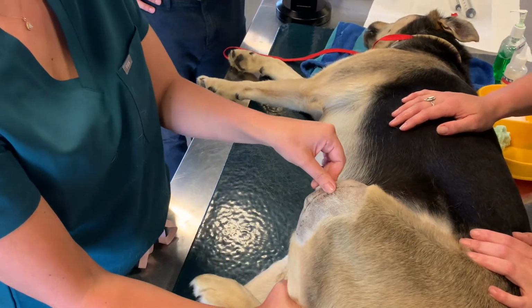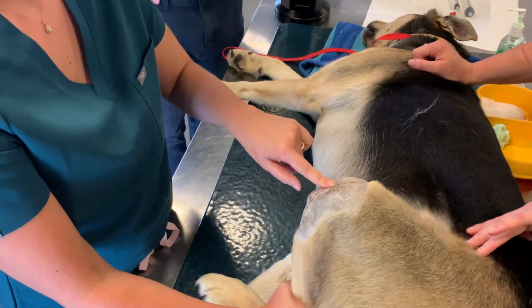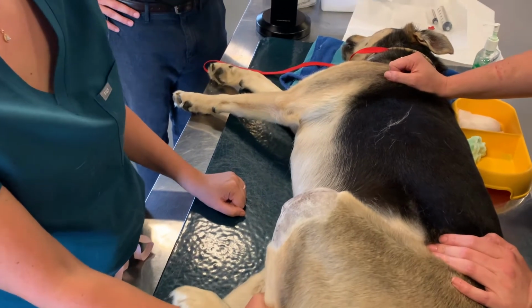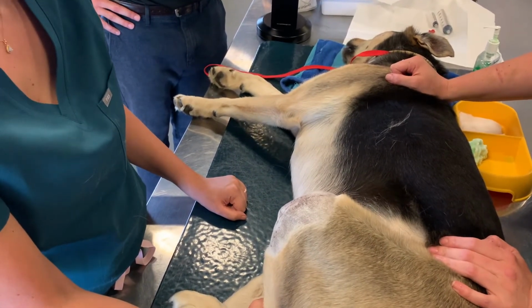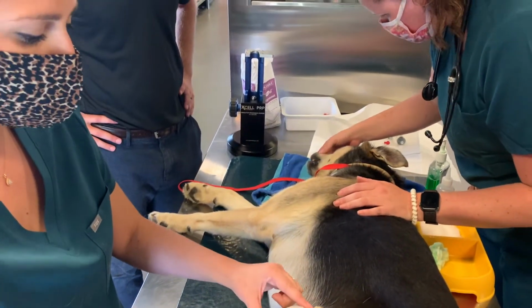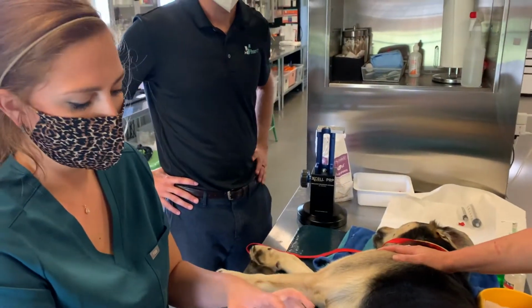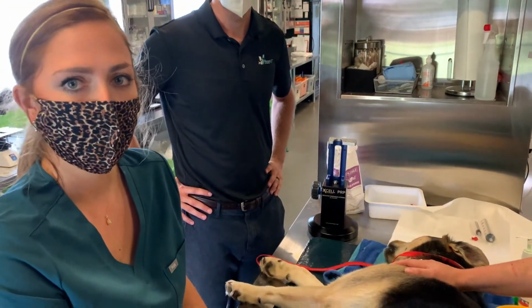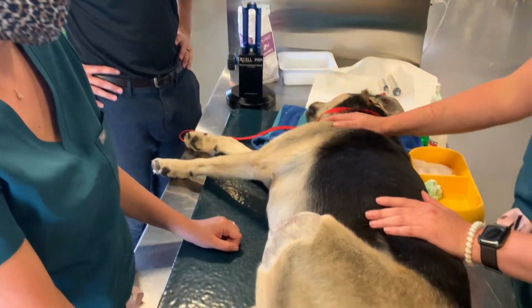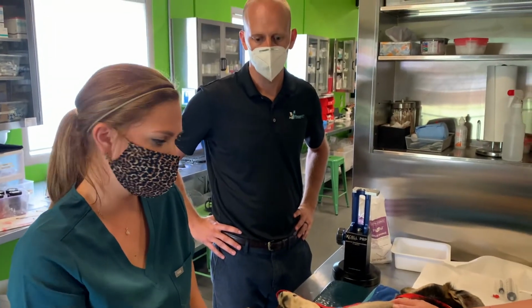And when you flex the knee, it's going to open the joint to allow you to get in there easier. Okay, and then what do you usually experience when you're injecting PRP and stop? As soon as you get resistance, because what you don't want to do is overload the joint capsule, put pressure on that. That's going to be painful. Yeah. So as soon as you feel resistance, you should stop. And the amount you can inject is going to be dependent on how much fluid is already in the joint. Yeah. And how much space. Okay.